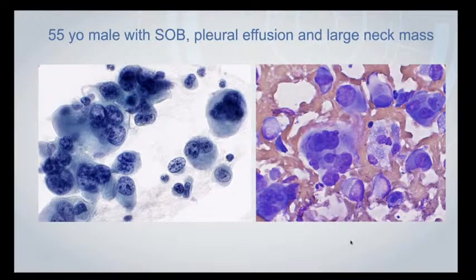Okay, we will move on because we have a little bit more to cover today. So here's a case of a tumor that is really not difficult to diagnose as malignant. This is an anaplastic thyroid carcinoma, and this is a fairly standard example of one. These are hugely pleomorphic. These are typically enormous cells. Look at this neutrophil here for size comparison, and look at the enormous and variable size of the malignant cells.